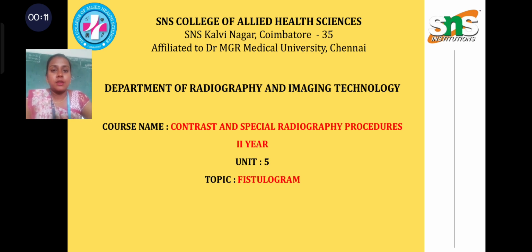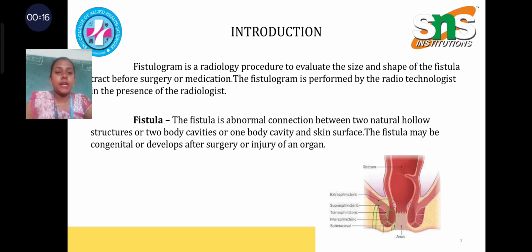I am going to discuss a topic about fistulogram. Fistulogram is a radiology procedure to evaluate the size and shape of the fistula tract before surgery or medication. The fistulogram is performed by the radiotechnologist in the presence of the radiologist.